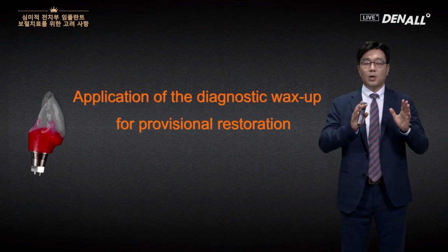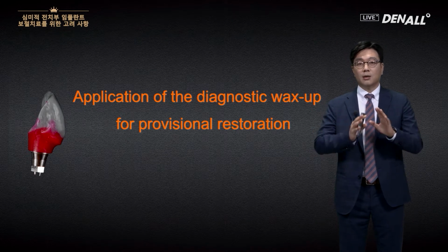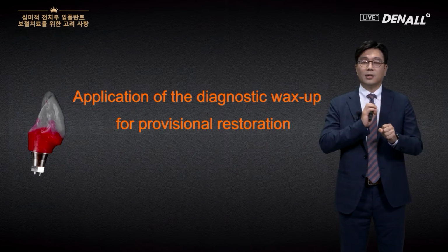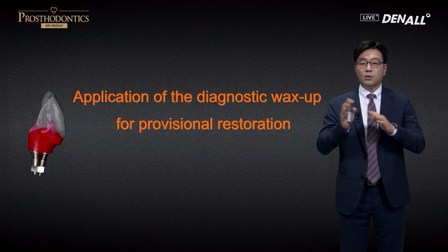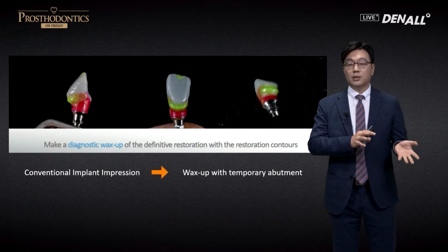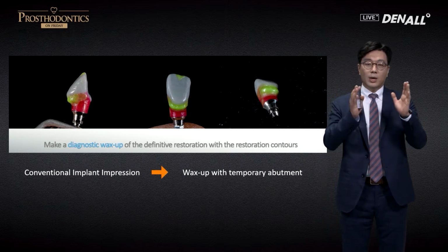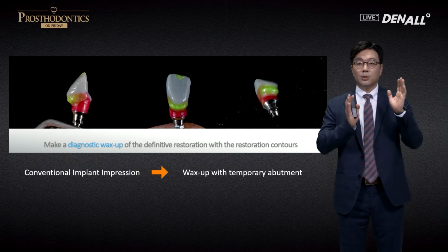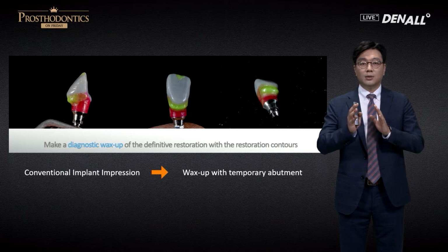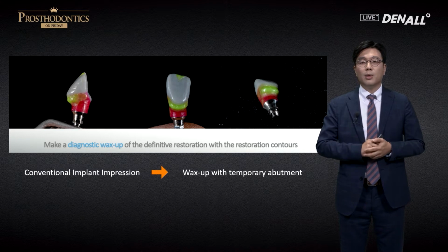Basically, how I fabricate the provisional restoration, during that time, diagnostic wax-up is used by communicating with the lab, and connecting it and disconnecting it is minimized. Impression is taken, and diagnostic wax-up is made. Clinical crown and white aesthetics is left to the lab, and a lot of communication needs to be made with the lab. The condition of the patient should be shared with the lab.